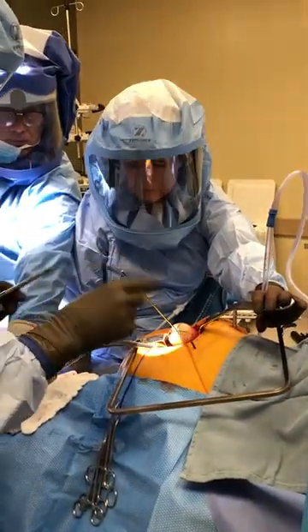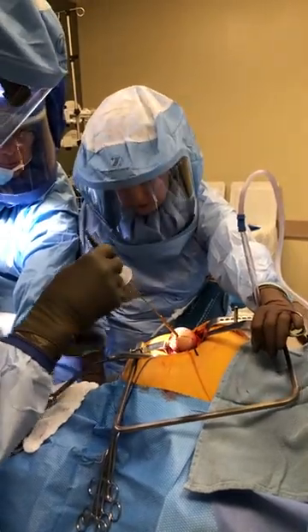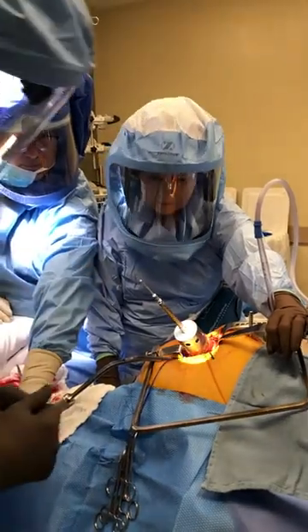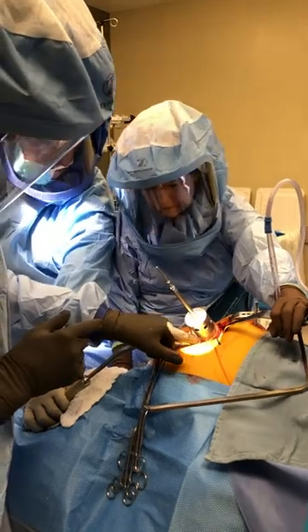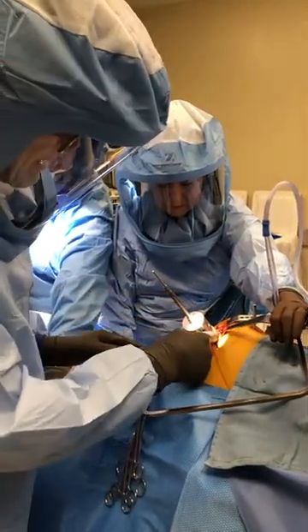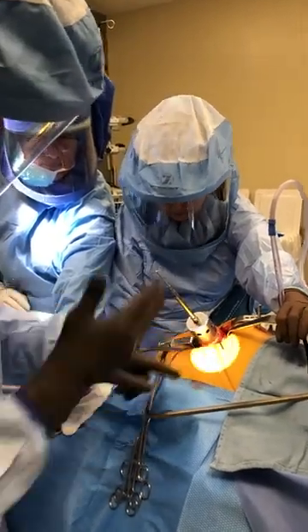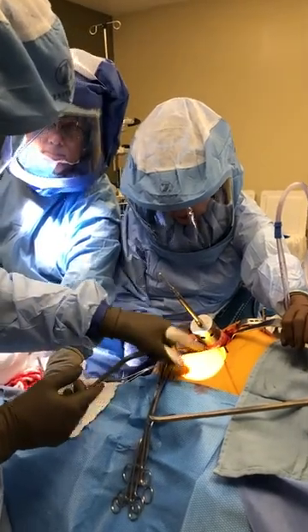So now we have a little sleeve to just double-check the cut position. I can visualize where the barrel cutter is — this is now the 52 barrel cutter. I can see it's going to barely scive the anterior side, take off more on the posterior side, and barely cut the superior. I like that because it prevents notching. In a cam case, this would be perfect.